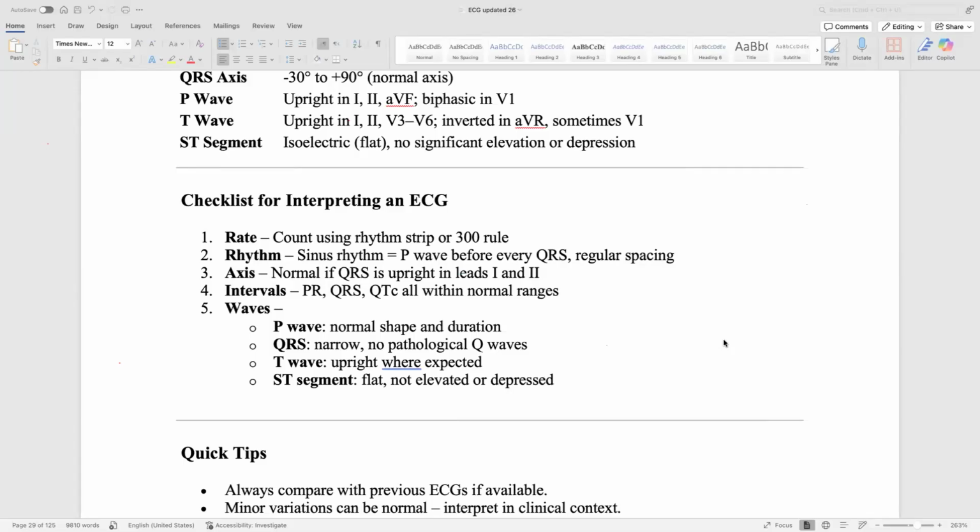After we count the heart rate, if the heart rate is 140 and everything is regular, it is still sinus tachycardia. But if it is 160, what is the significance of that? And the patient has only mild discomfort and palpitation. SVT. Just the cutoff point of 150.